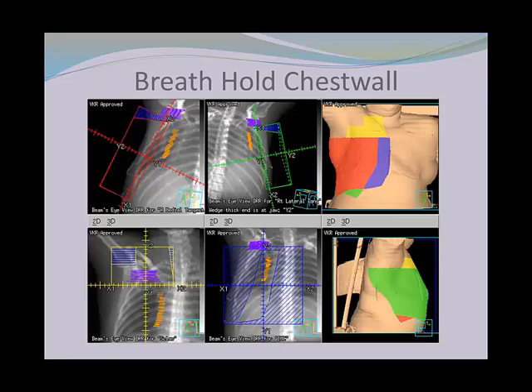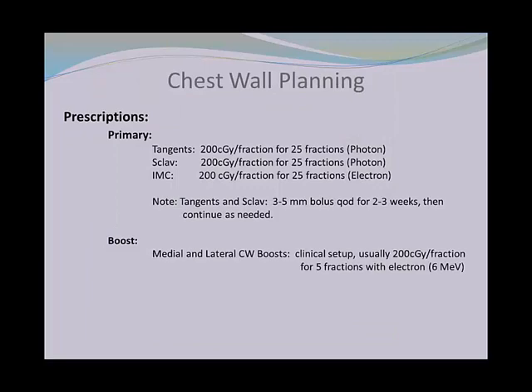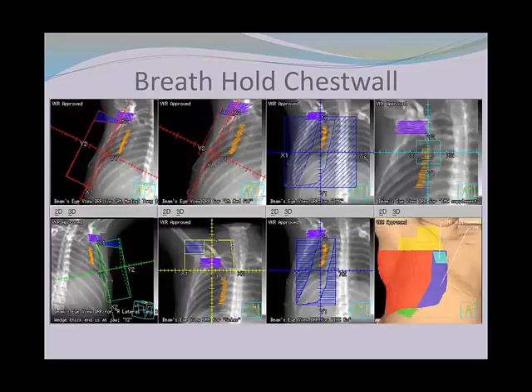And then for the supraclavicular field, to get the coverage to the depth that we needed, depending on the patient thickness, of course, you can use 6x or 18x. Sometimes we mix 6 and 18, going to appropriate Dmax just to get the coverage that we need.